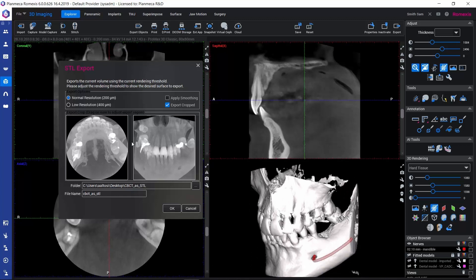We have further options here in this dialog. We could drop the resolution a little bit in order to get a smaller file, but then we might lose some details. Also, if we apply smoothing, that would smooth the surface, but again we could run the risk of losing some details.